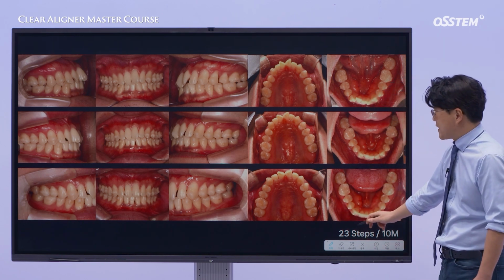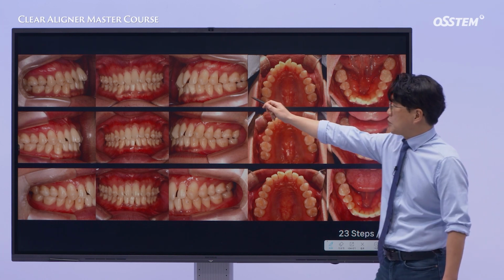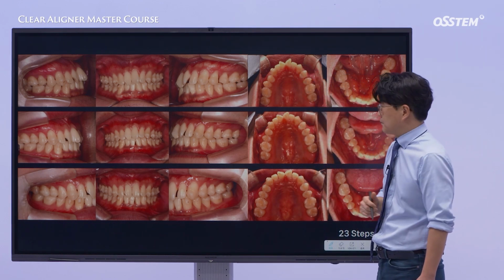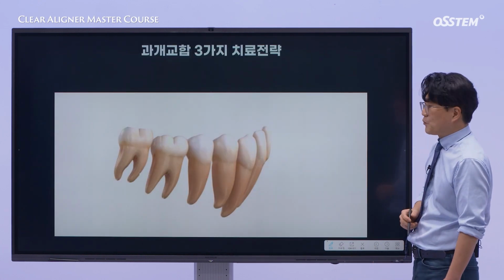The treatment was carried out over 10 months using 23 aligners. You can see that the deep overbite was corrected relatively early. The results are quite good. We used a total of 23 aligners.